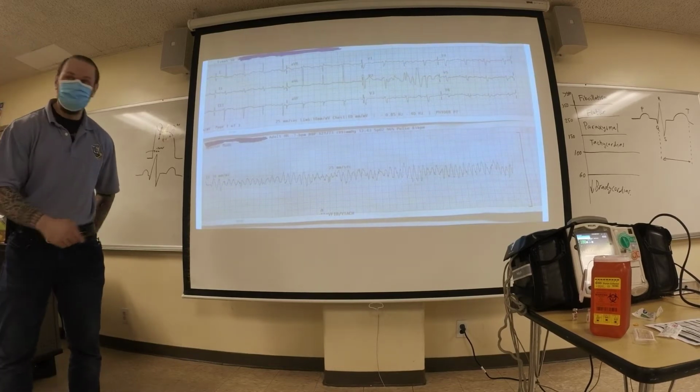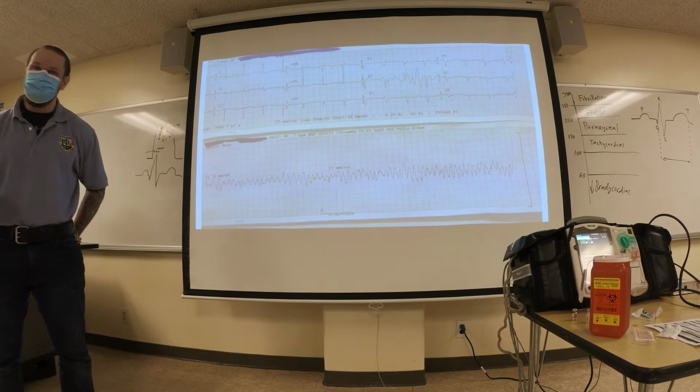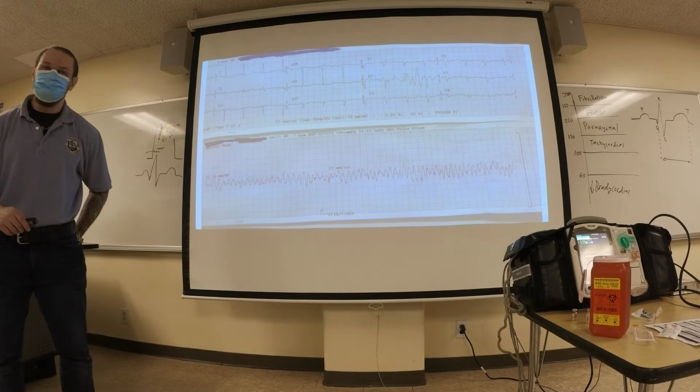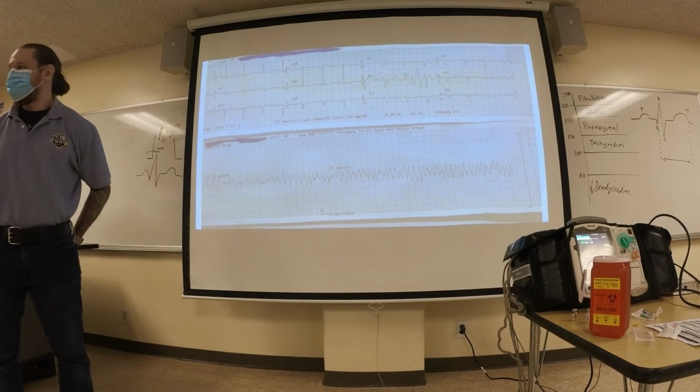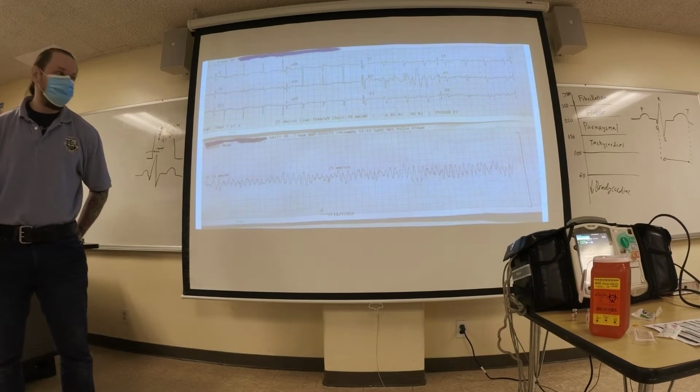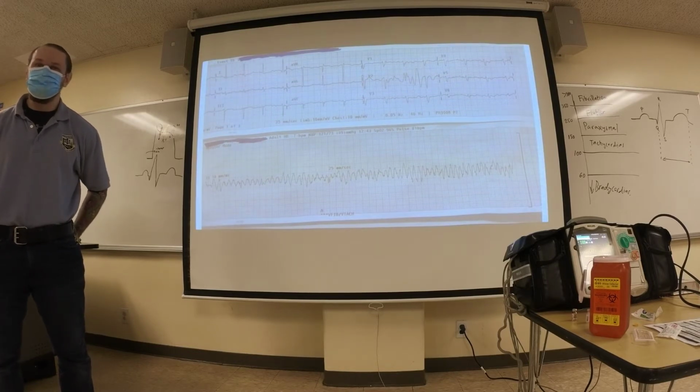And if your patient is oriented times 3, is it ever VFib? No, usually not. There's only one condition where your patient has VFib and they can talk to you. There's only one condition, and it's very, very obvious. Is it the wrong monitor? No. Artifact? Well, it could be artifact, but let's say there's no artifact. Let's say it's legit VFib and the guy's talking to you.